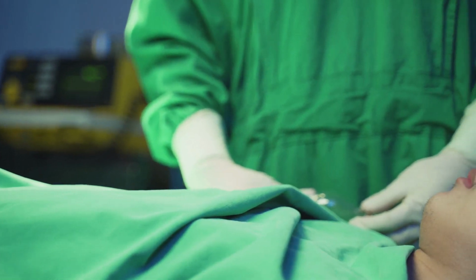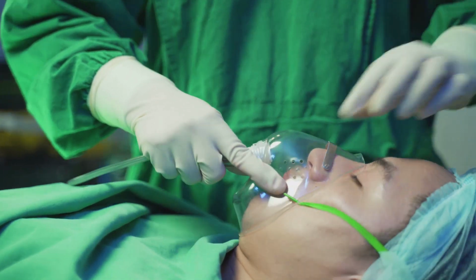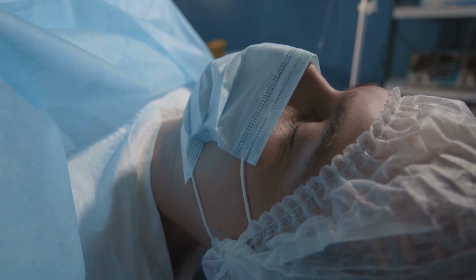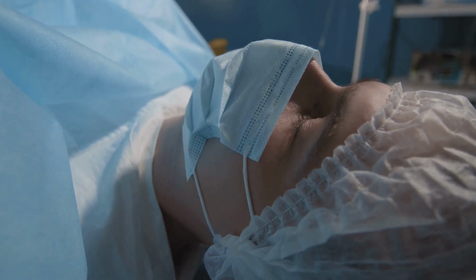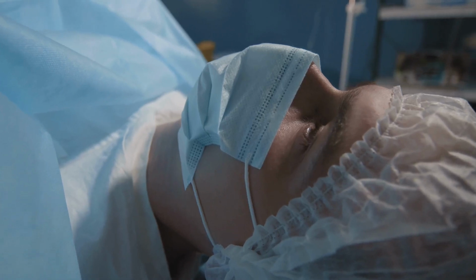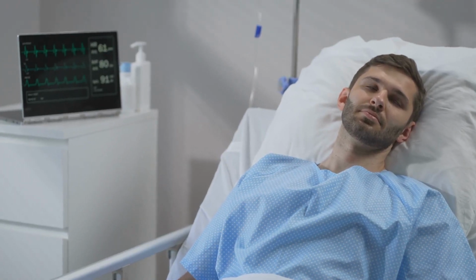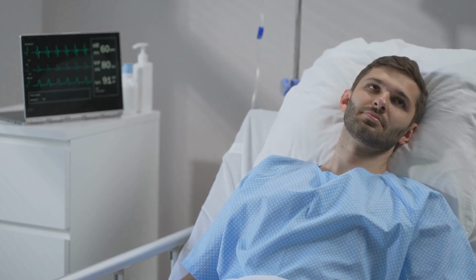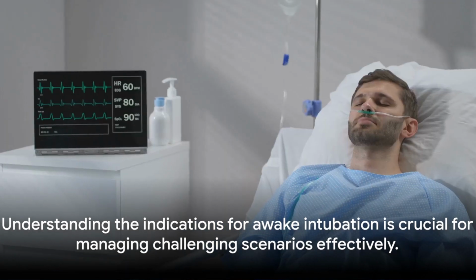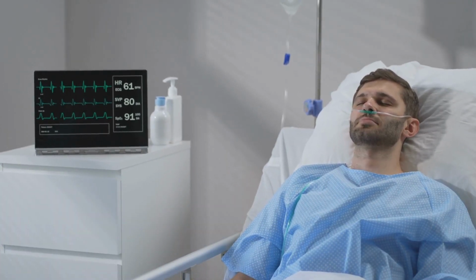Awake intubation is also used when a patient has a significant risk of aspiration, such as those with a full stomach or severe reflux. Another indication is the need for ongoing respiratory support, as seen in patients with severe respiratory disease or neurologic conditions affecting the airway. Lastly, awake intubation is often performed in patients who need to be awake for neurological evaluation during the procedure. Understanding when to use awake intubation is the first step in effectively managing these challenging scenarios.